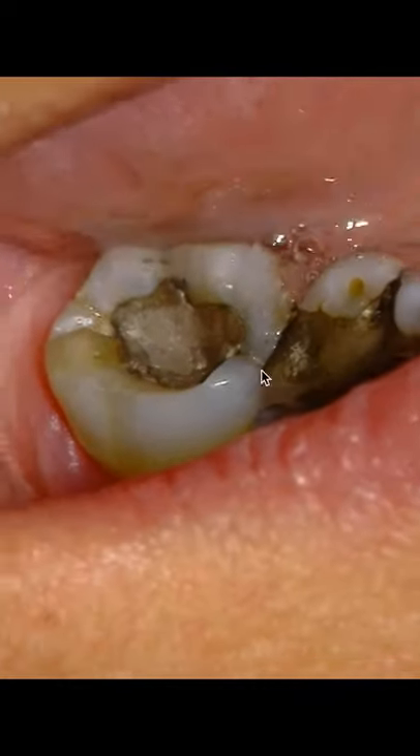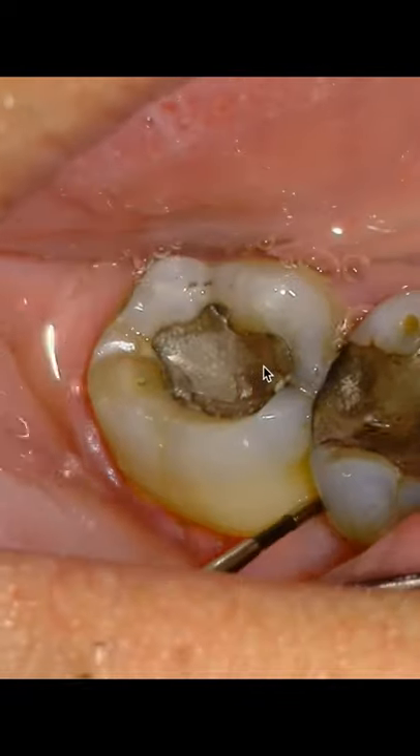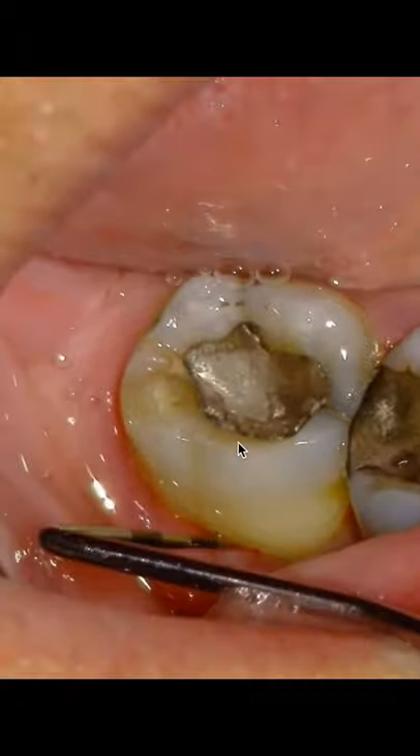Another way we can check: so you see this on your radiograph, do your probing tests — those are critical, don't skip that. You can do your cold test, that's helpful. It's going to be necrotic; this tooth is necrotic. But watch how this furcation just swallows that probe, and it's not perio.